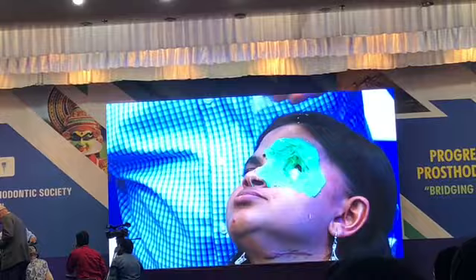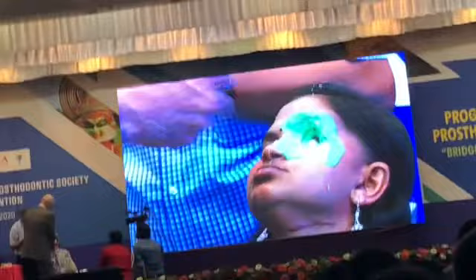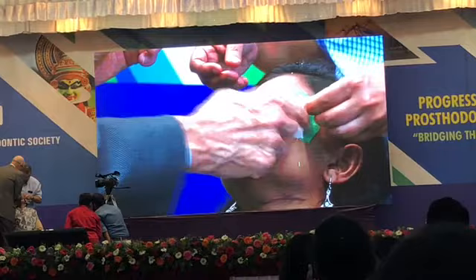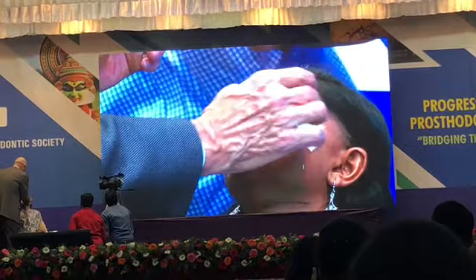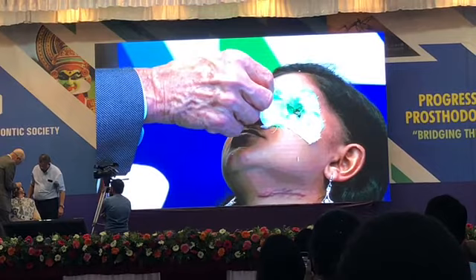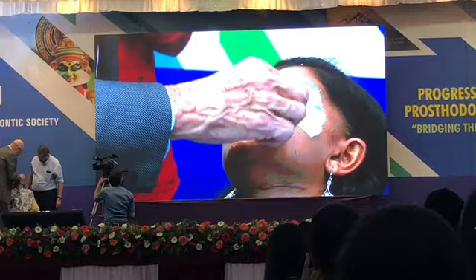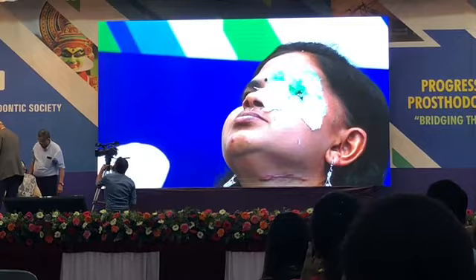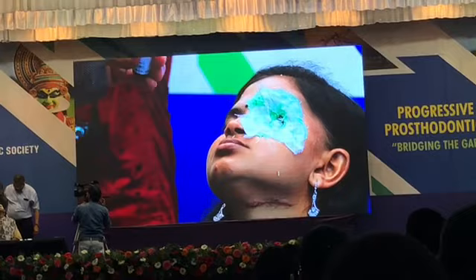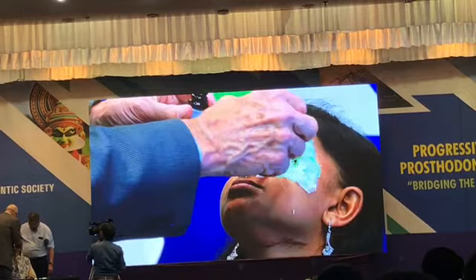Okay. Now we take the gauze. That the gauze is nicely adapted. Now, the adhesive. What's the purpose of the tray adhesive? It sticks to the plaster a little bit better. Just a little bit. Just enhances the retention.